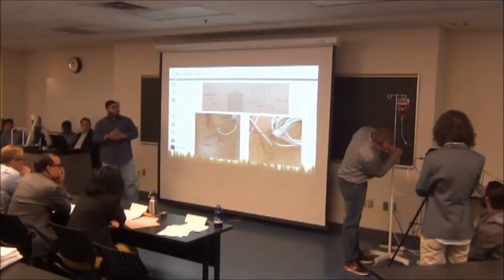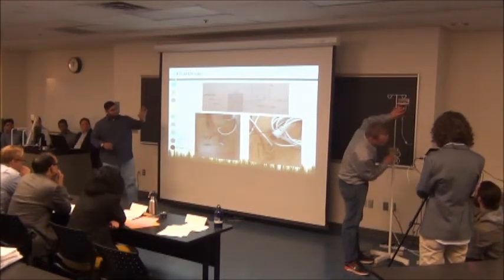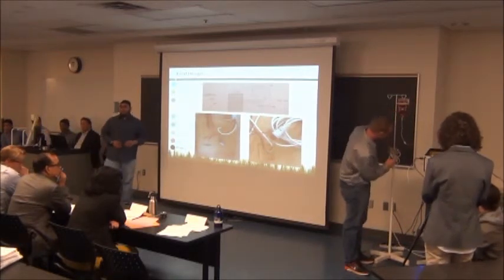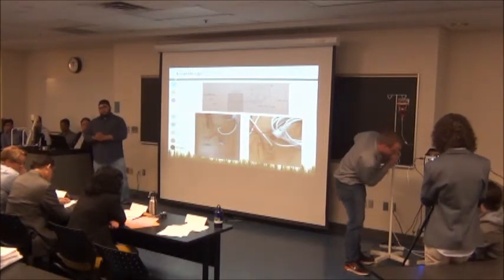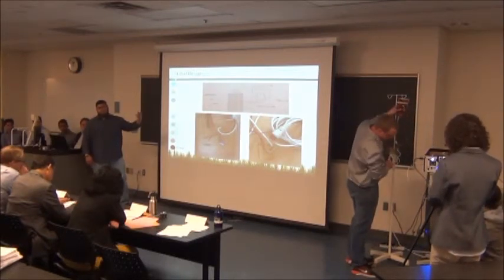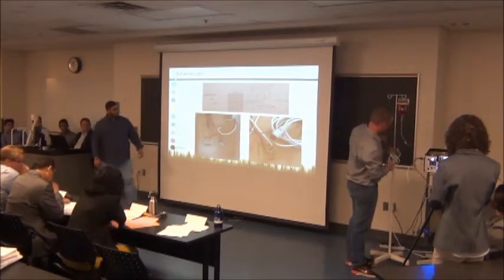Then when we mechanically move the IV bag, the sensor on the top moves. The sensor is a strain gauge or a flex resistor, so the resistance changes as it's flexed. And then that is taken to a bridge circuit, which translates the resistance change into voltage change. And that is then sent back to the monitor through the cable.